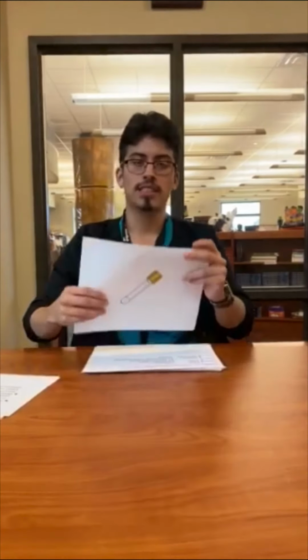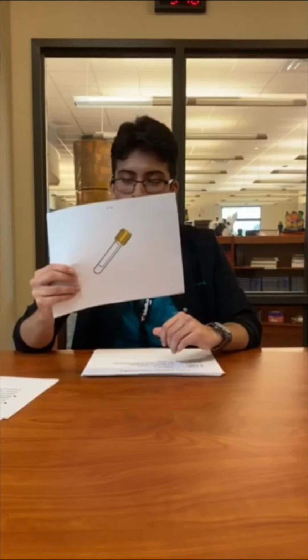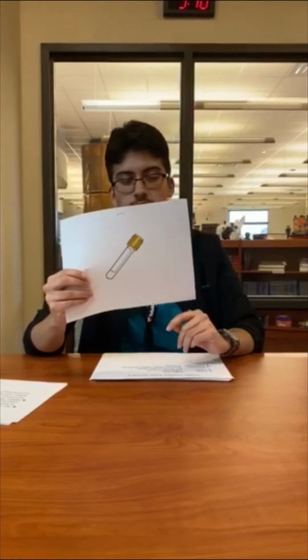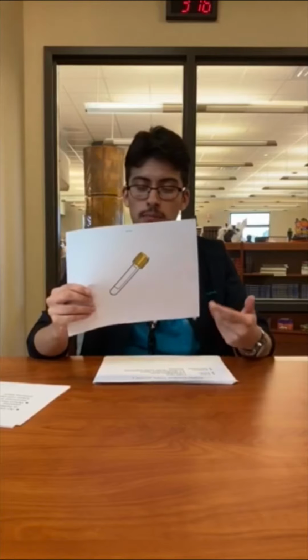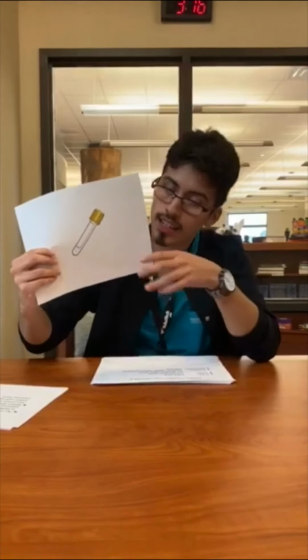Now the types of tubes that we're going to be encountering goes like this: stop light red, stay put green light go. Stop means sterile, or yellow. Its additive is sodium polyanethol sulfonate to inhibit complement and phagocytosis. Its specimen use is whole blood. You use this tube to recover microorganisms causing blood infection. So as you can see, stay is yellow.